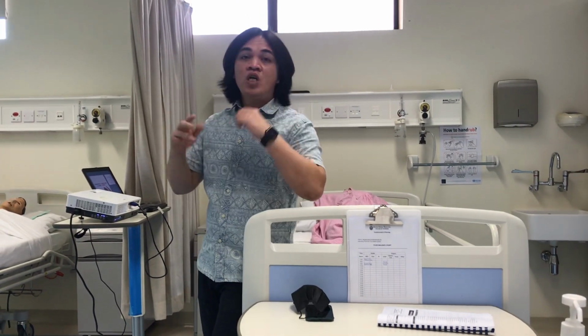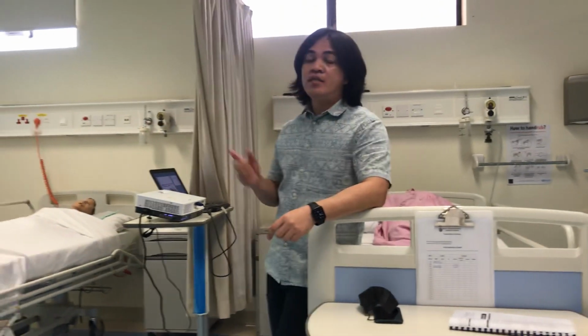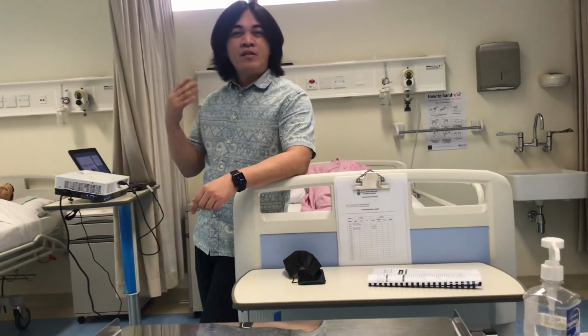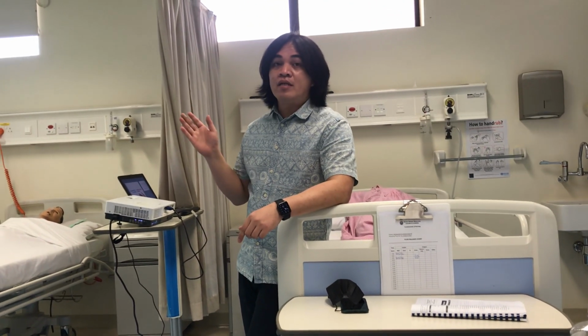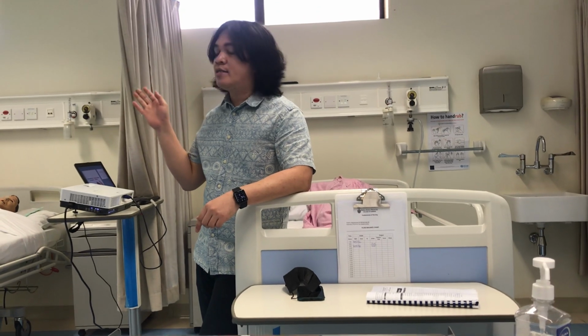Specifically, we will focus on surgical wound. Okay, let's say we have surgical dressing. And the basic concepts in this topic have been discussed already in theory, the different types of wounds, the treatments, all has been discussed already. So for the purpose of our lab session, we'll start with surgical wound dressing.